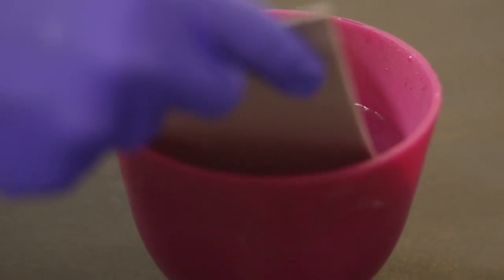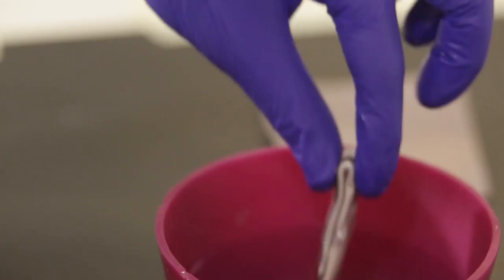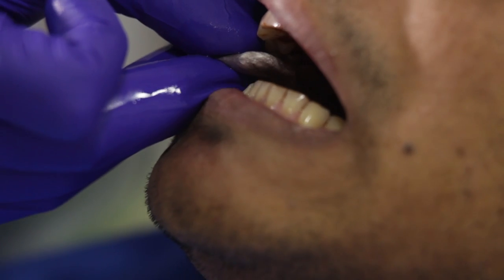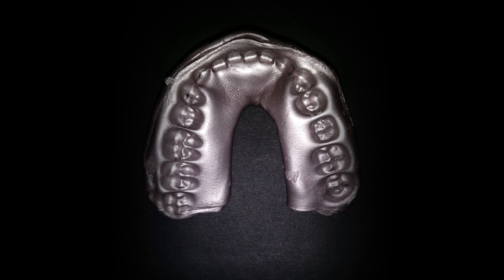You can soften the wax in hot water and fold it over. Put it into the patient's mouth and ask the patient to bite. It is extremely important to have the wax only over the prepared teeth. I see a lot of bites at the lab with the entire arch, which is really not needed — in fact, it may lead to inaccuracies in your bite, in the sense that the patient may not be able to close fully into maximum intercuspation.